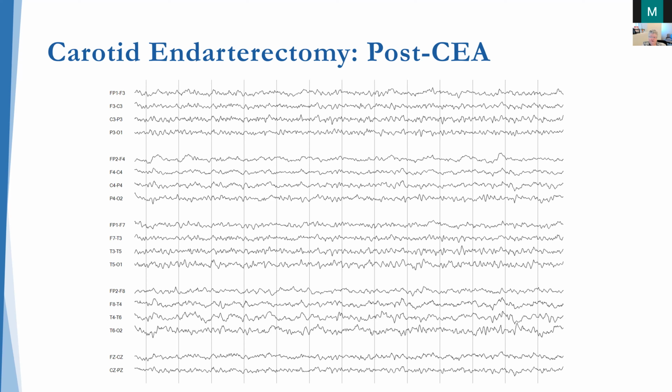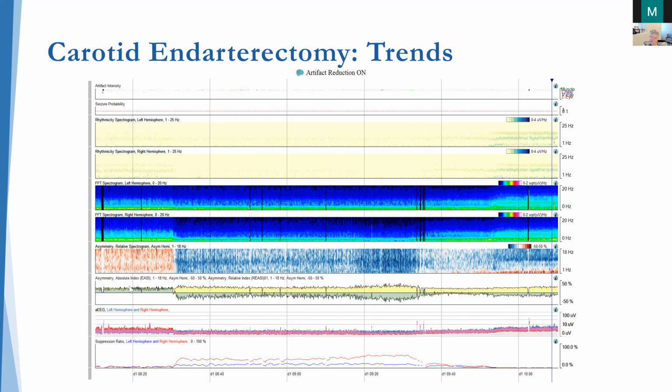So it's actually far more striking. So this is EEG over time along the x-axis. We have several different panels here, including an FFT spectrogram, but I'm going to really focus on this asymmetry spectrogram. So initially, we see increase in power over the right hemisphere, particularly in the faster frequencies over the right hemisphere. More red on that side.